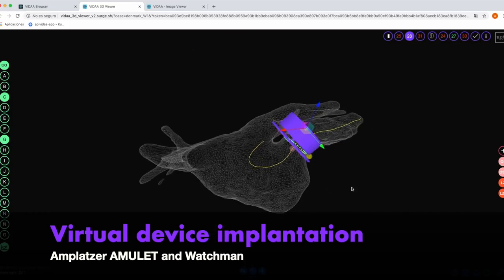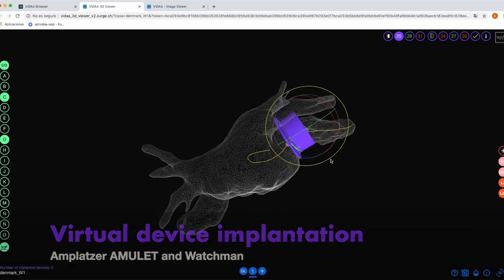So in silico models that simulate the blood flow patterns in the left atrium can really contribute to determining which device configurations have a lower risk for the patients. But the challenge is that there is a lack of rigorous studies of verification, validation, and sensitivity quantification in the literature on this type of simulation.